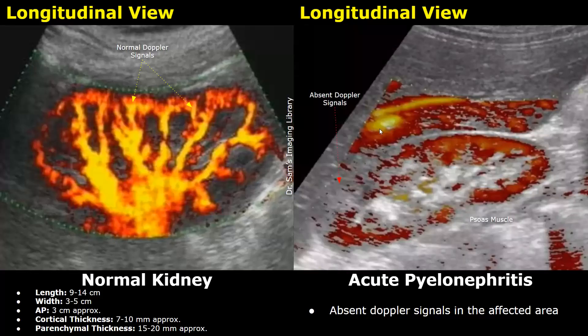This is another case of acute pyelonephritis where the upper pole of the kidney was affected, and you can see absence of power Doppler signals in that region.